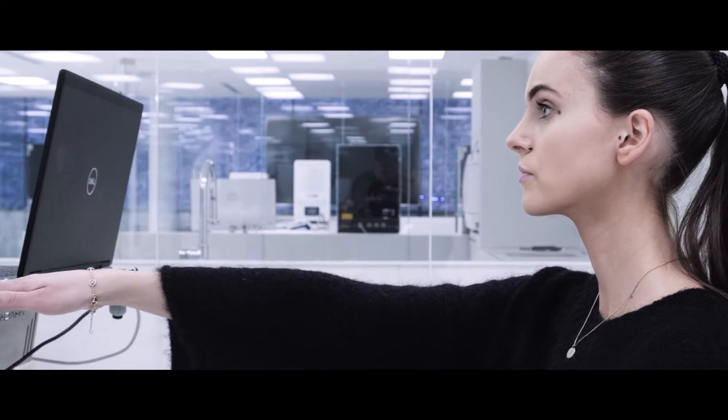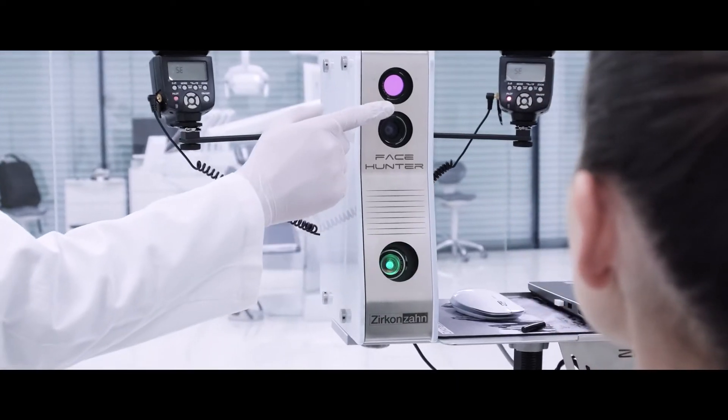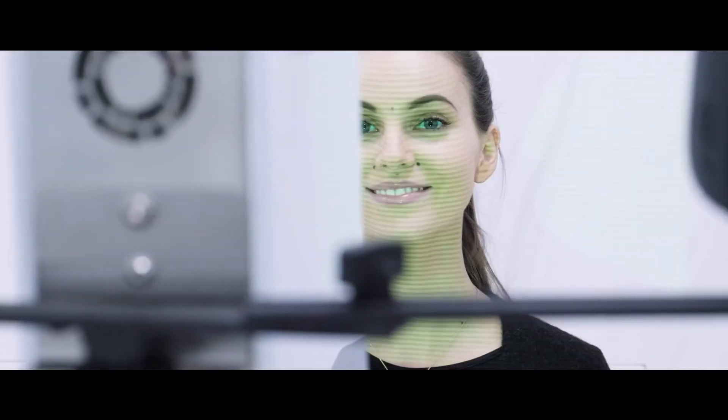The FaceHunter is properly distanced from the patient before starting with complete acquisition of the face in neutral expression. At this stage, a frontal scan, a 45-degree right lateral scan, and a 45-degree left lateral scan are performed. Then the dentist takes scans of secondary views with smiling, open-mouthed, and possibly phonetic expressions.